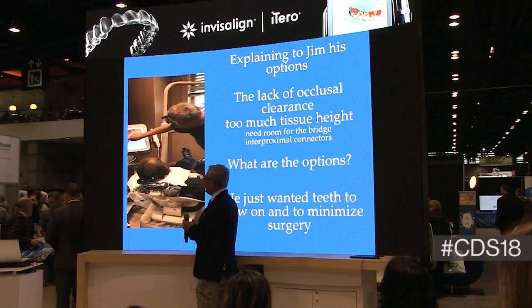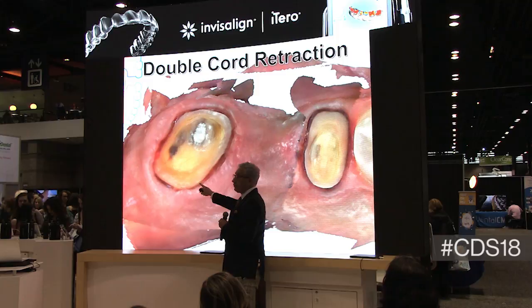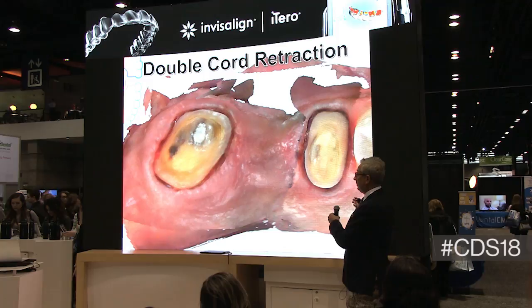their throat. And when you're done, you can absolutely see what retraction does. If your lab can't see these margins, then there's something wrong. This is the beauty of digital. The ADA just did a study, and most dentists can't even read their own impressions, much less the lab then. This is so easily read.